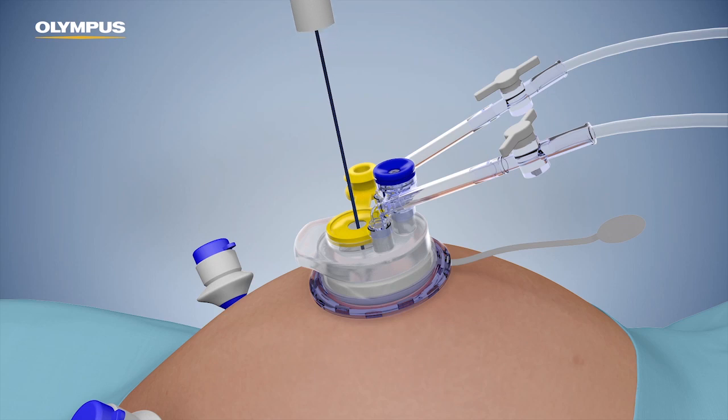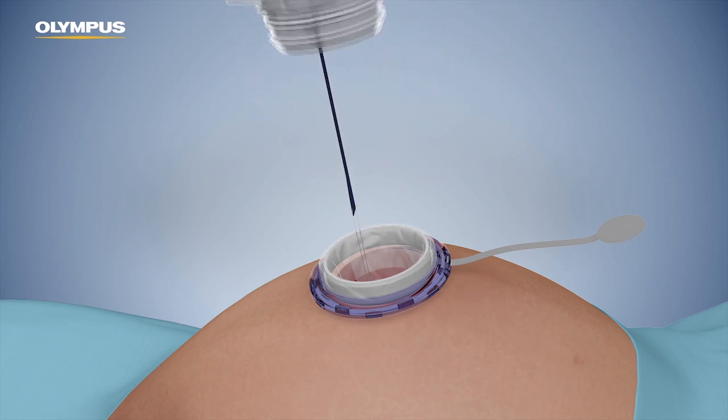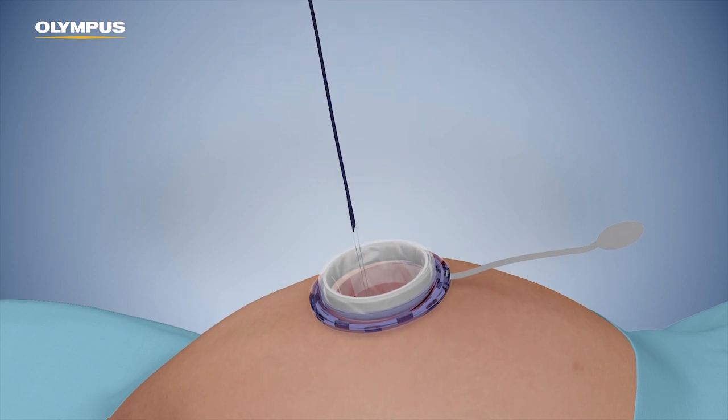Carefully pull the tether to close the pneumo liner. Continue until the opening ring is partially pulled through the yellow valve and the pneumo liner is closed. Remove all trocars to prevent the pneumo liner from being damaged during desufflation. Detach the boot using the removal tab and remove it from the tether while the abdomen is deflating.